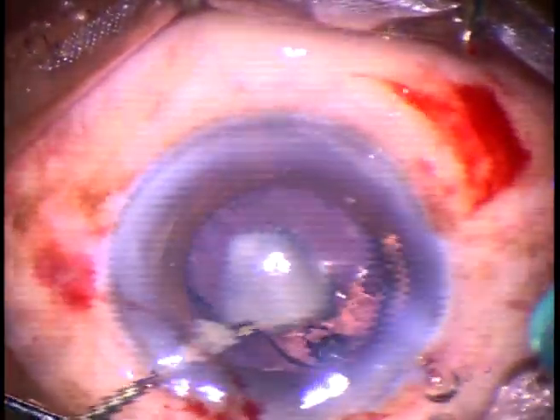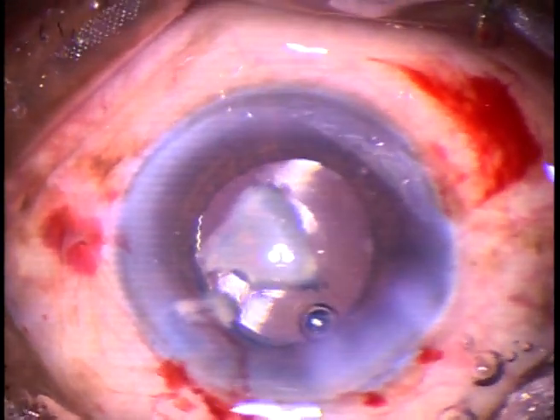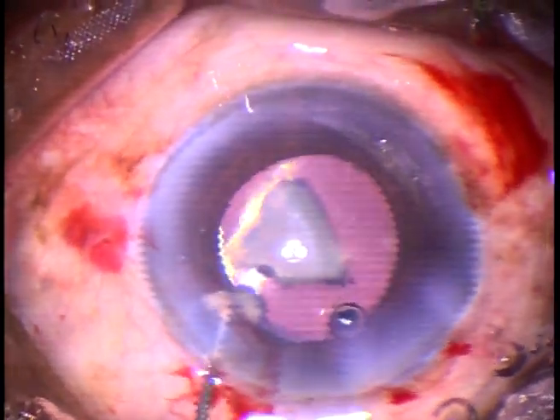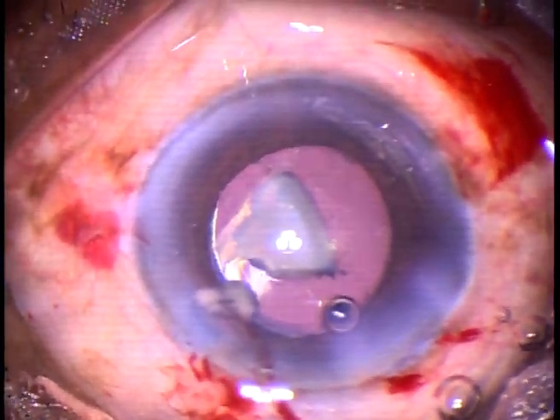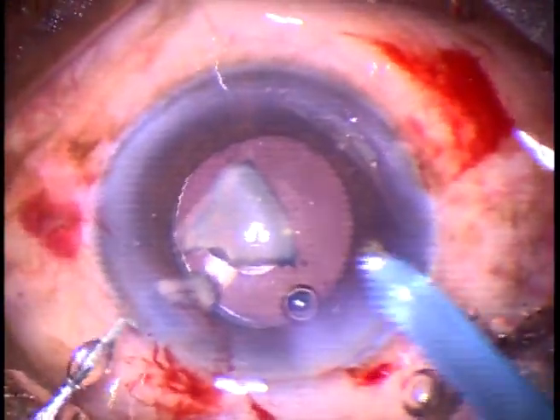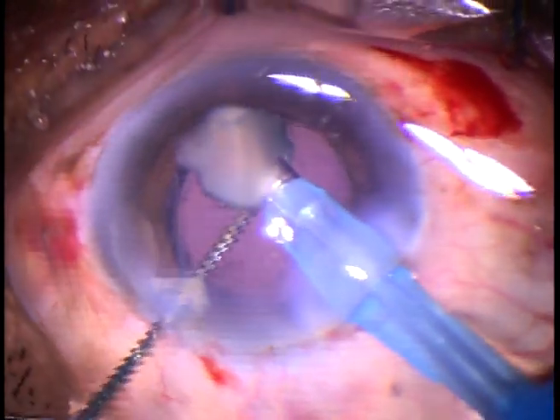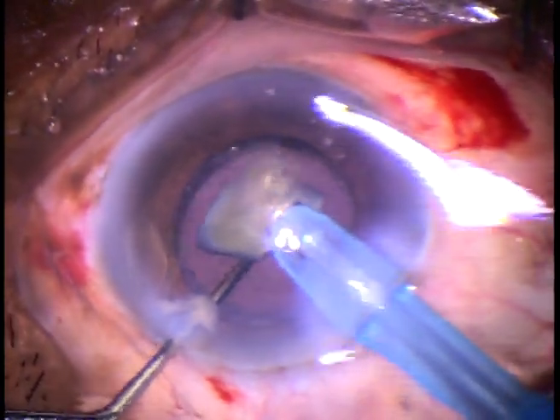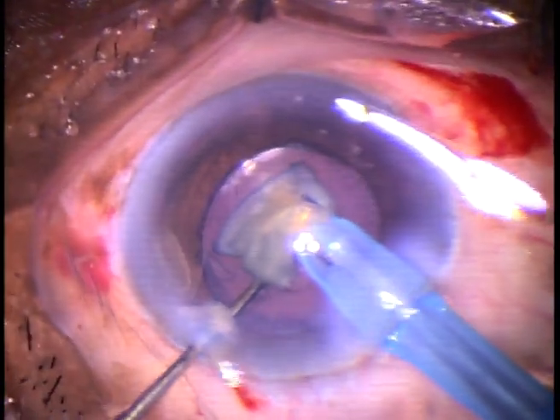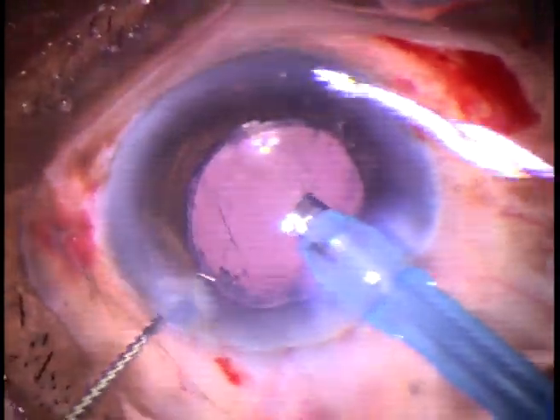This is a hydrophilic acrylic single-piece monofocal intraocular lens. Now, over this lens, this nuclear piece is going to be emulsified. We must take care not to touch the lens with the tip of the phaco needle while we apply ultrasonic energy. So the chopper is pushing the lens down and the nuclear piece is being emulsified at the iris plane, just above that.